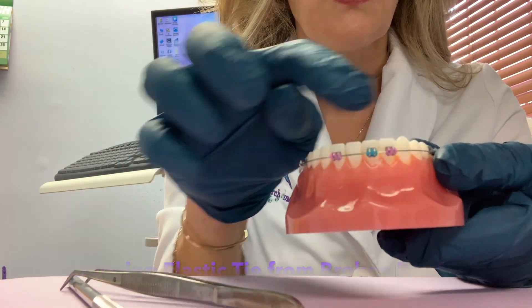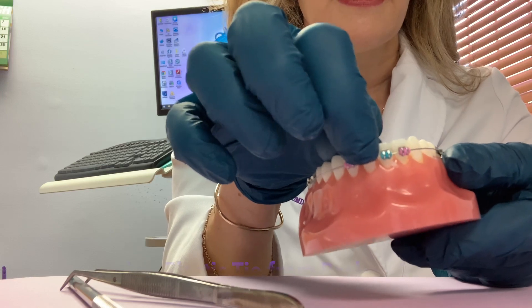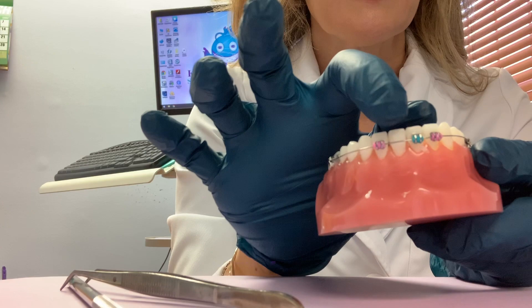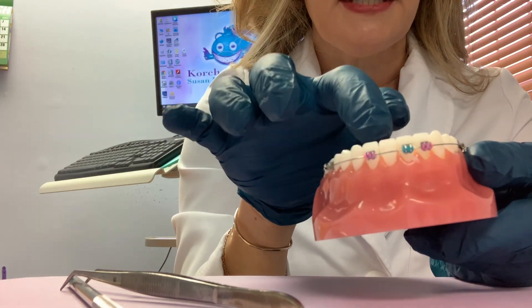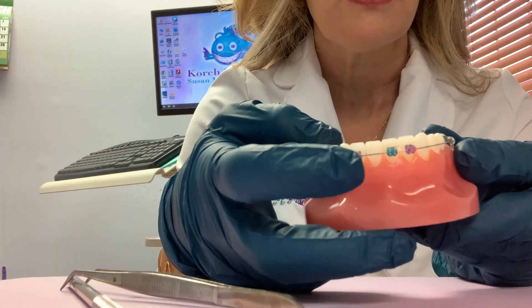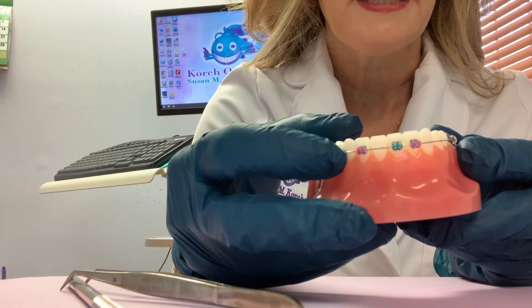In this case, the teeth around the tooth that doesn't have a brace will still be stable, but the tooth without the brace will no longer be attached, so it may shift. If it does shift, not a problem — as soon as we can get you back for your treatment to restart, we will put the brace back on that tooth and it'll line up in no time.